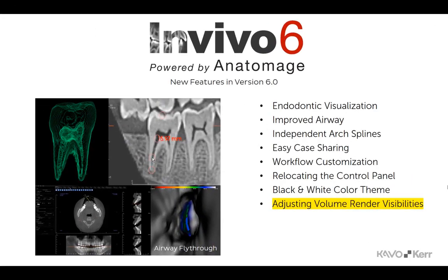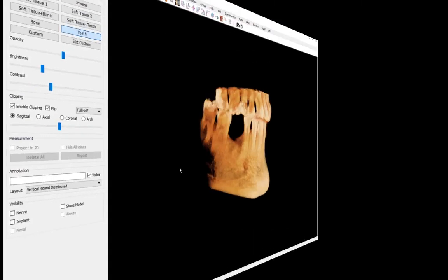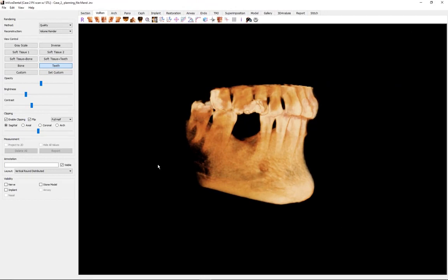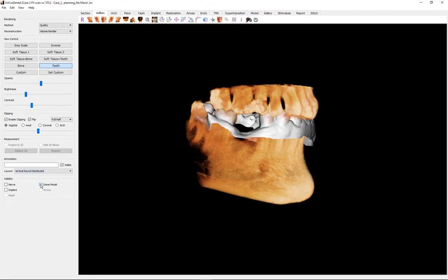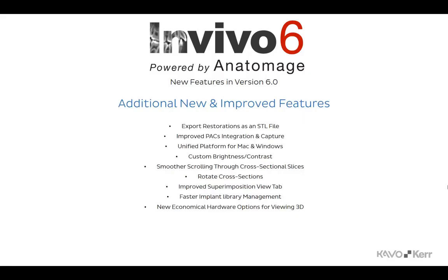NVivo 6 allows the user to adjust visibilities in the Volume Render View tab. In the Controls section of Volume Render, the user may toggle on and off placed nerves and implants, stone models, and traced airways and nasal cavities.